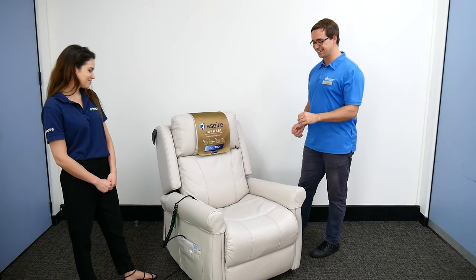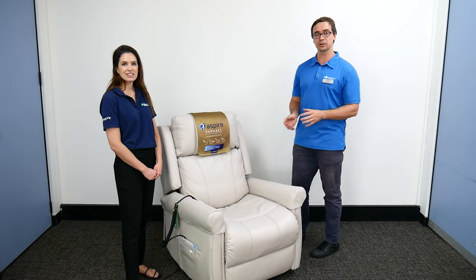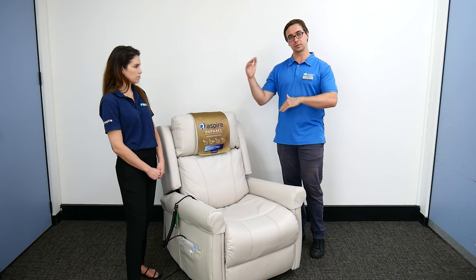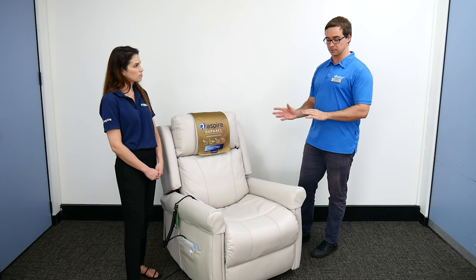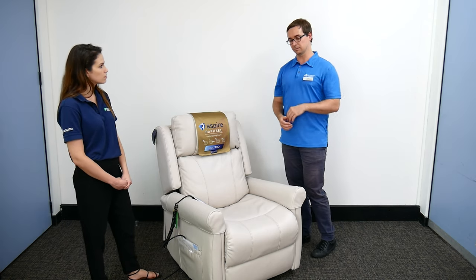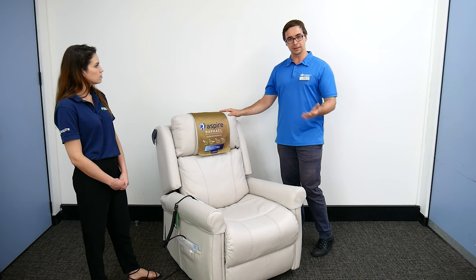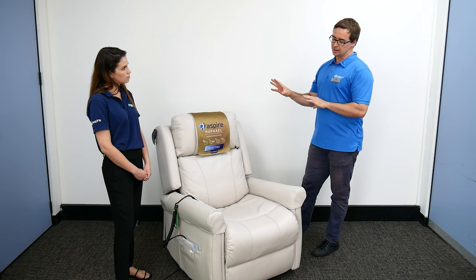Even though there are only four buttons, there is a learning curve. During a trial over 15 minutes or so, working through the features with a client, you can see whether they're comfortable navigating it. This does become a safety concern because if someone is unable to navigate the controls, they could get stuck in the chair. Someone living with a cognitive impairment who finds themselves reclined and unable to get out may try to climb out — so even though it looks like simple equipment, there can be serious clinical considerations.